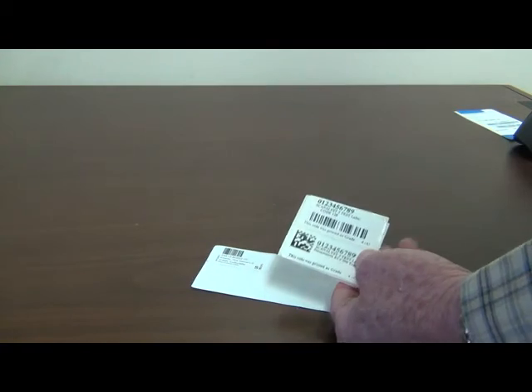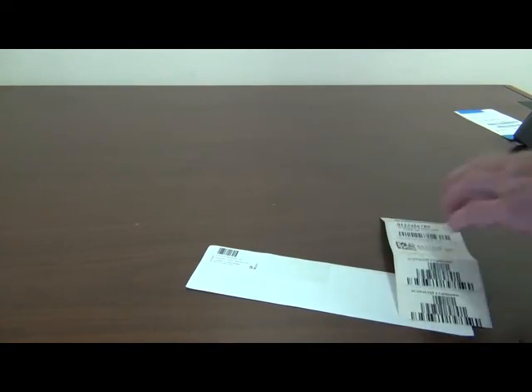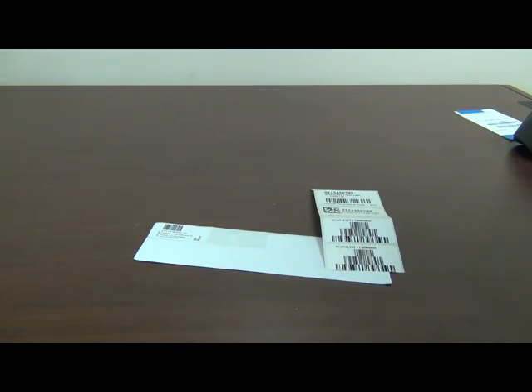And that allows your IT people to narrow the range of possibilities in use in the hospitals to Data Matrix and Code 128. And that makes their job of maintaining the scanners and helping you out a lot easier.